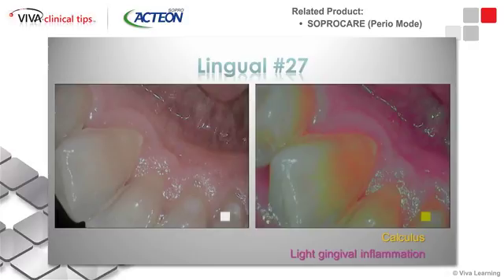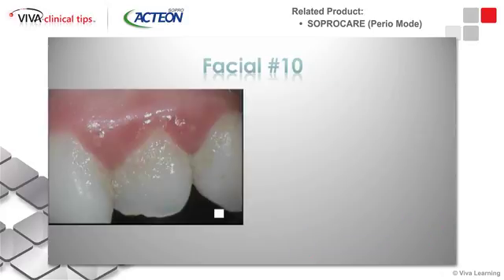So again, what is commonplace to us, I can't tell you how many times I have this beautiful large image, and I'm showing the patient, and they're like, well, it's white, just like my tooth. I'm like, well, it's a different color white. And you can tell they're trying to be respectful, but they don't see what we see. And some of them can, they'll pick up on it, but the more obvious it is, and this one right here, I don't think is very obvious. It's very subtle, but it's much more obvious when you use the technology.